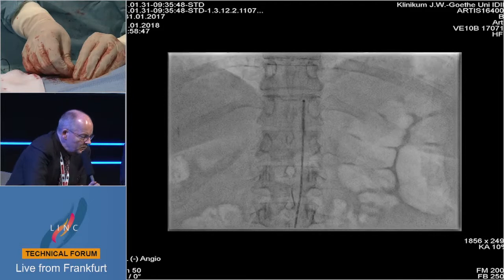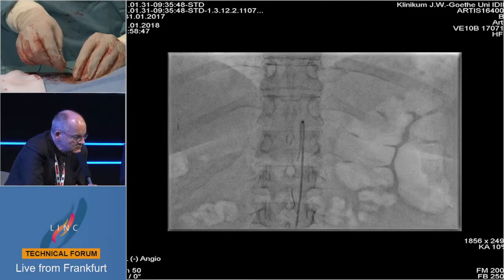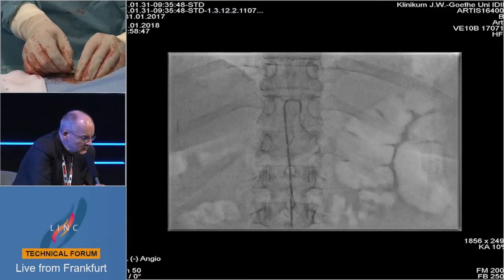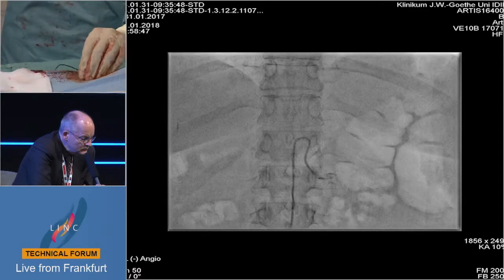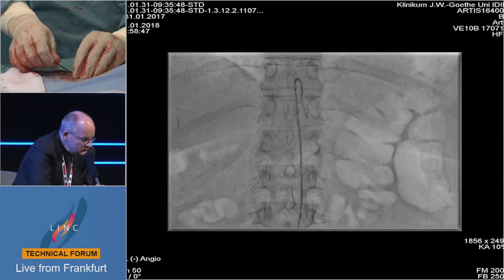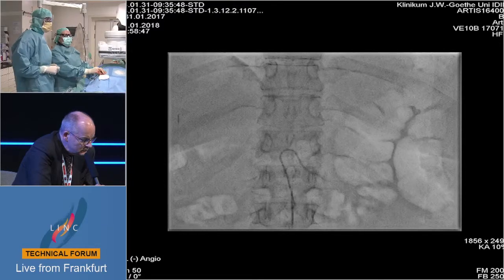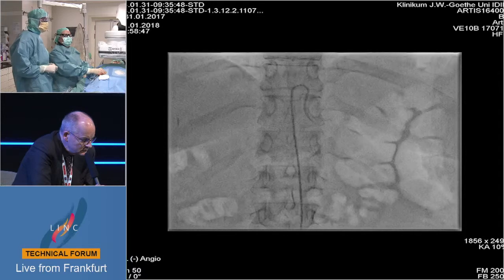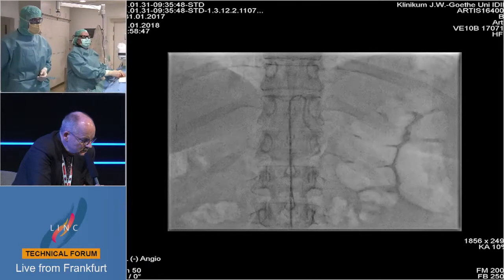Maybe Dr. Bodel, you can meanwhile explain to us what material you are using. We now have a sidewinder catheter 5F. At this time we use it to place it in the celiac trunk. As you see, we have a special situation at this time because we have no access to the celiac trunk, and we'll find it right now, I hope.